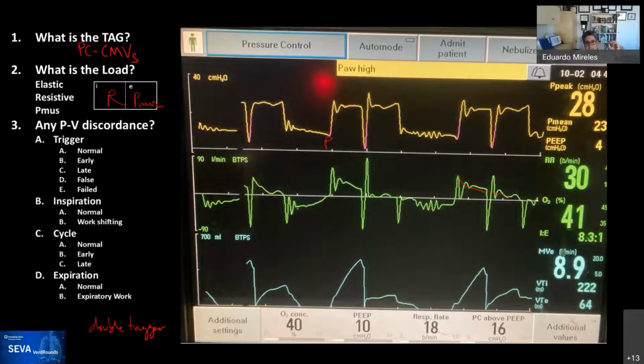And you can actually see the flow, how the patient is doing effort, and then he transitions to take a breath in. The breath triggers, and the pressure goes up, then it goes down, the flow goes down, then up. So the ventilator is trying to maintain the pressure at the set inspiratory pressure that you have placed for him. So it goes up and down, trying to calibrate, to adjust. And then it cycles off.